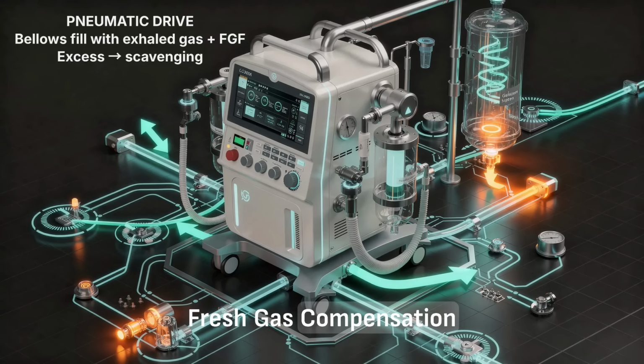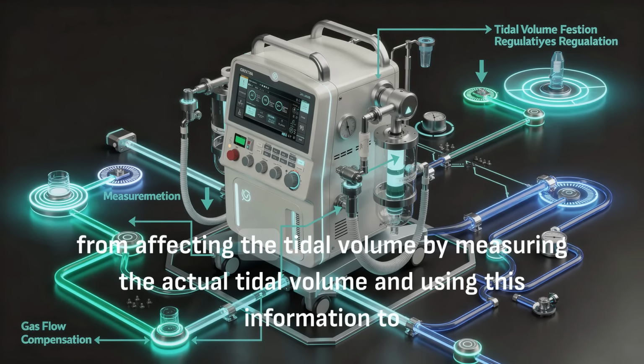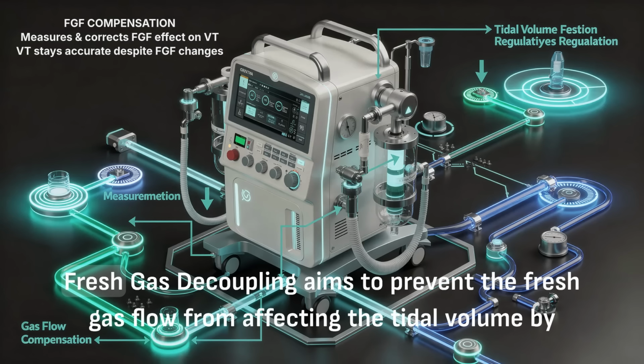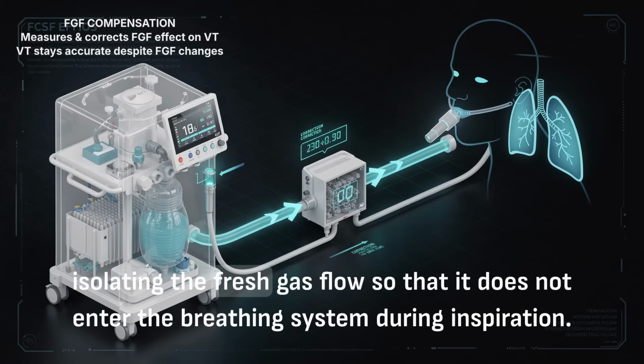Fresh gas compensation means preventing the fresh gas flow from affecting the tidal volume by measuring the actual tidal volume and using this information to adjust the volume of gas delivered by the ventilator. Fresh gas decoupling aims to prevent the fresh gas flow from affecting the tidal volume by isolating the fresh gas flow so that it does not enter the breathing system during inspiration.